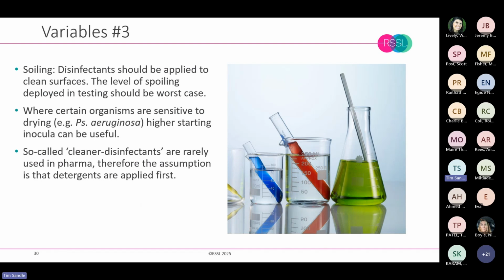So unless we've got exceptionally good cleaning and good application of detergents, our clean room surfaces will probably have residues of something behind, protein, grease, something like that. So it's important that in our disinfectant testing that we at least understand what the effect of trace residues of soil are.